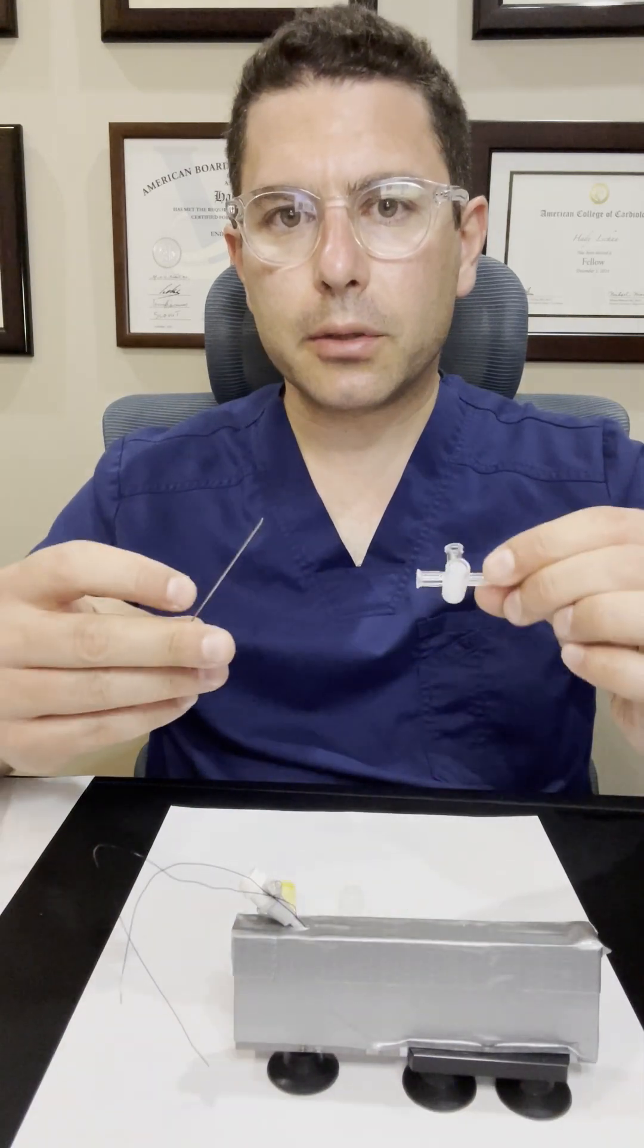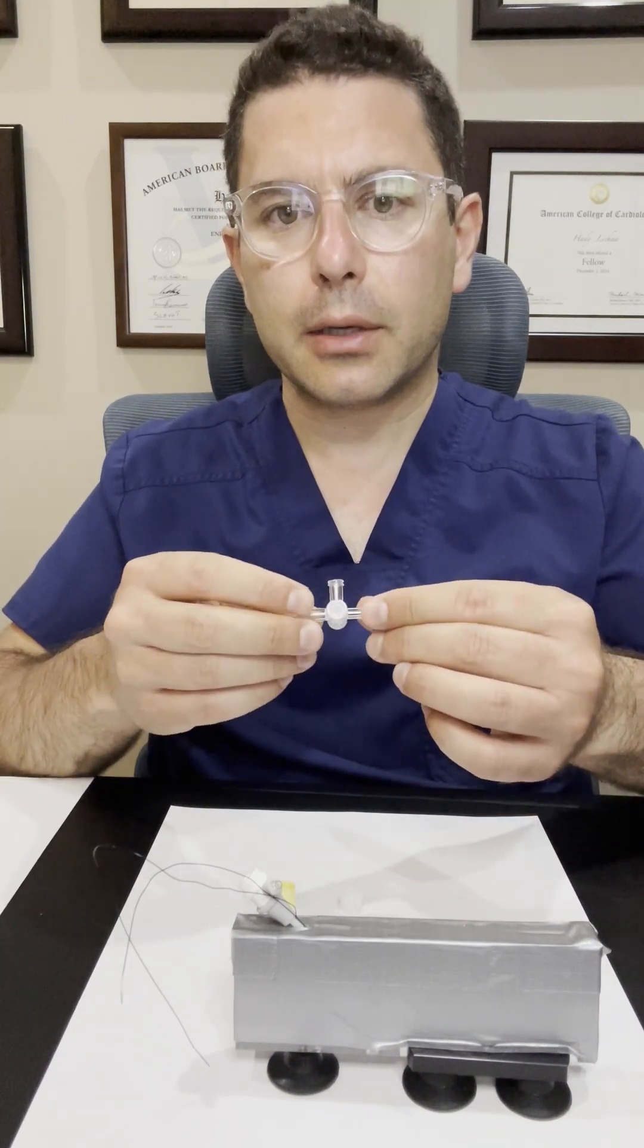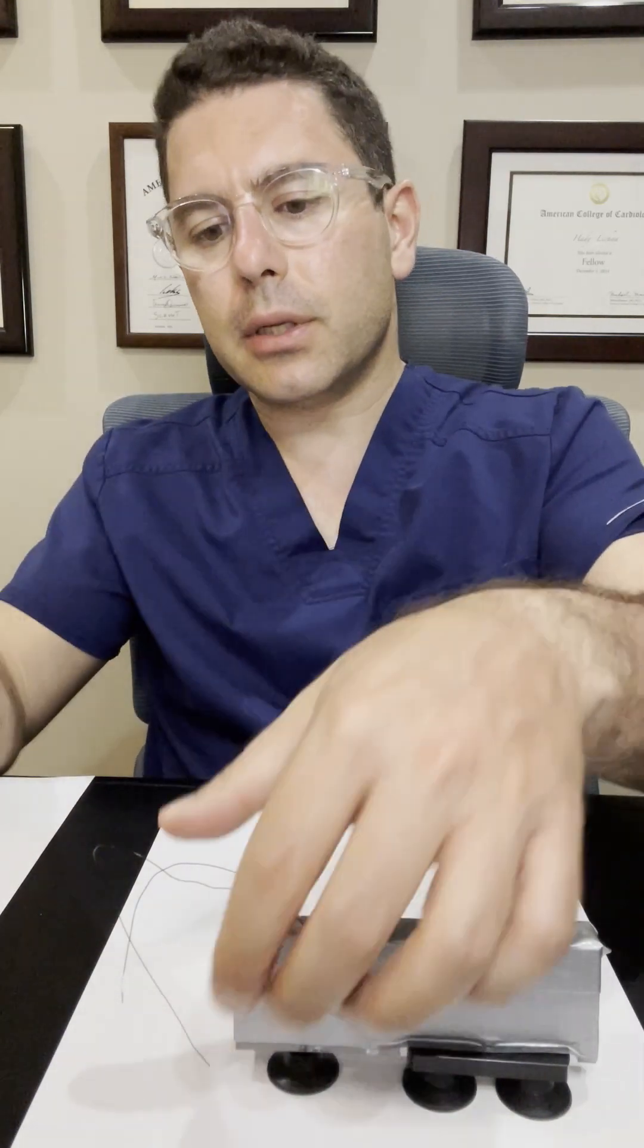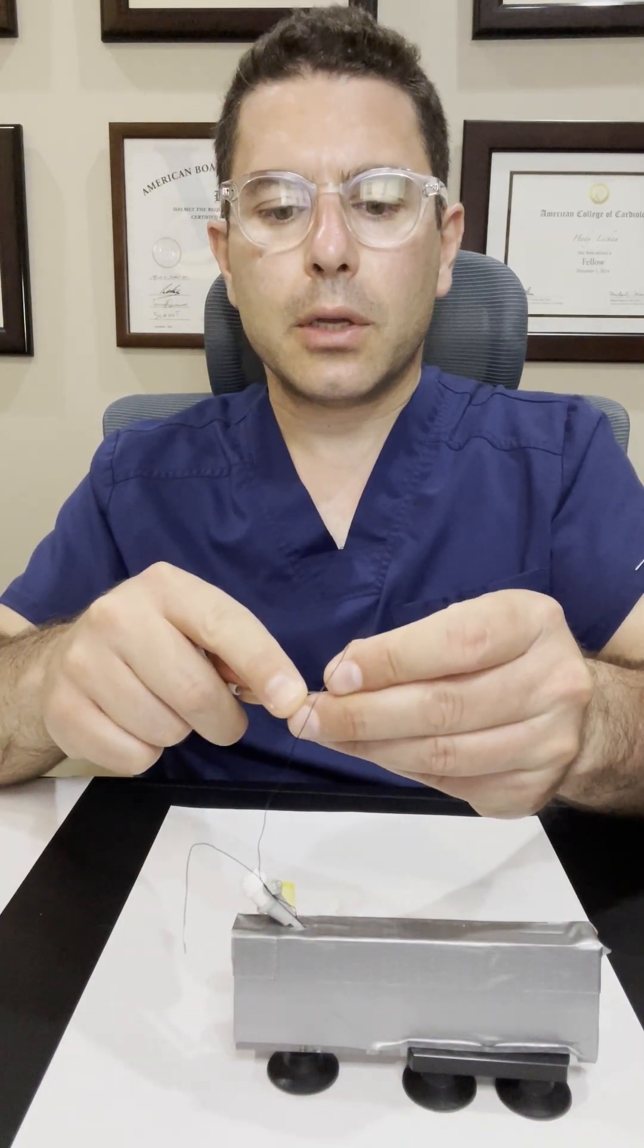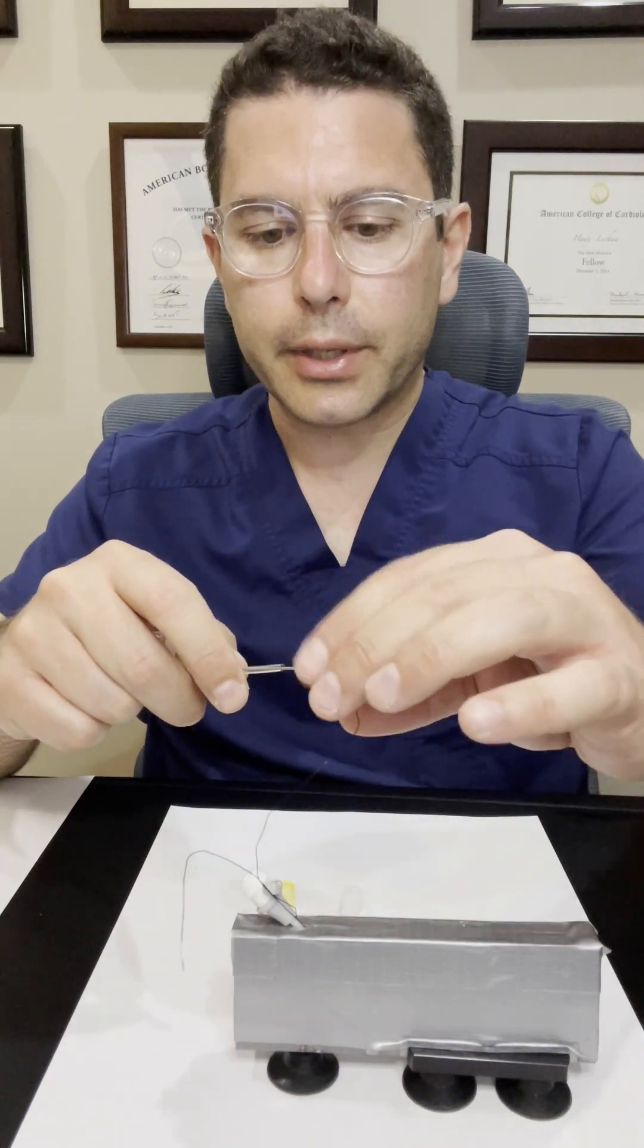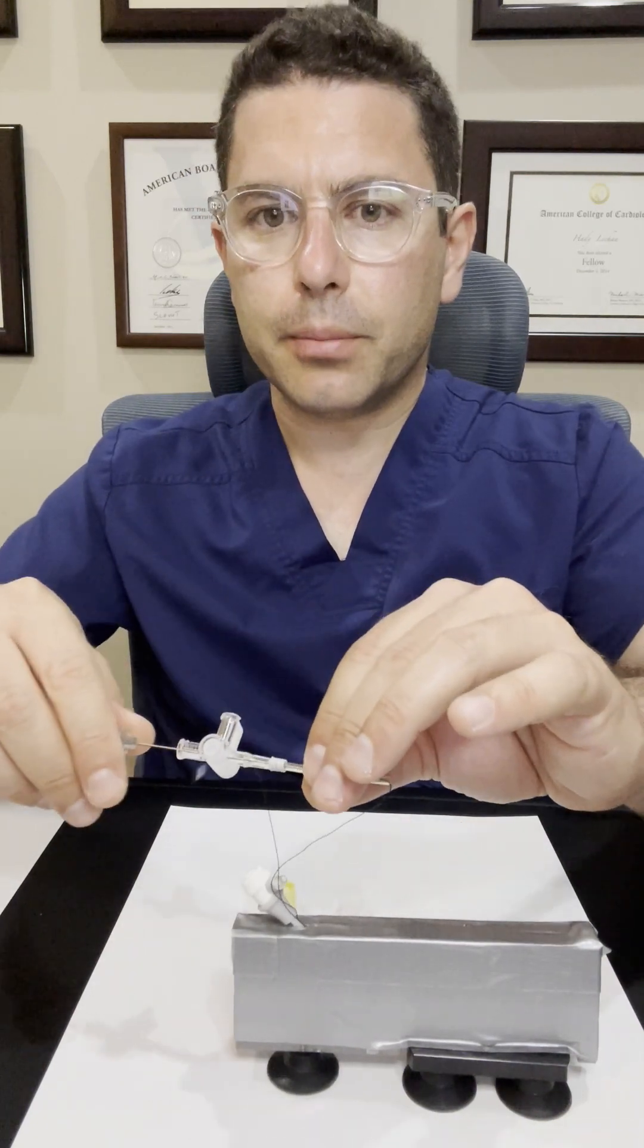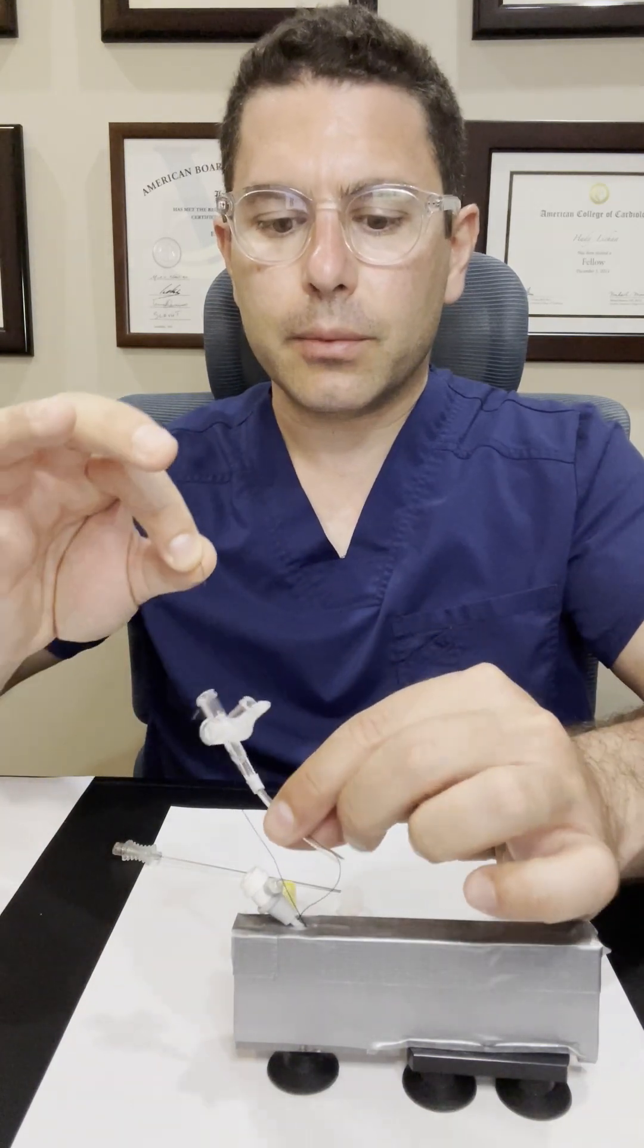So the first part of this technique is to open up the sheath side port stopcock in an open position like you see here. You have the needle introducer, and basically the non-locking suture is pulled first. This does not have to be introduced all the way, a couple of centimeters into the needle introducer. Usually this will be pulled out this way, and you can see that suture coming out from the other side.